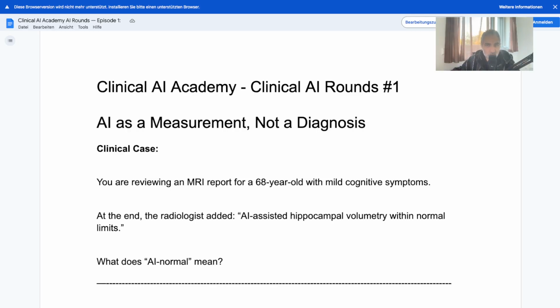These models that we use are extremely precise at quantifying subtle changes, but they lack context, so you need to provide the context. They don't consider, for example, other scores that you calculated for the patient, not yet at least, like cognitive scores, the vascular risk, medication history.